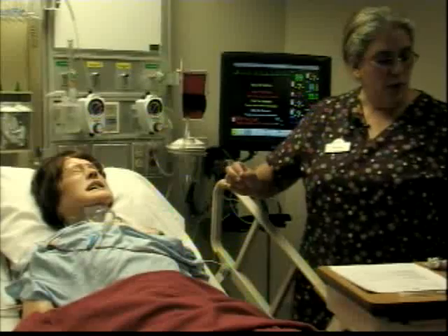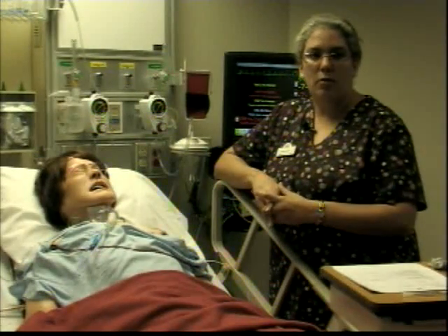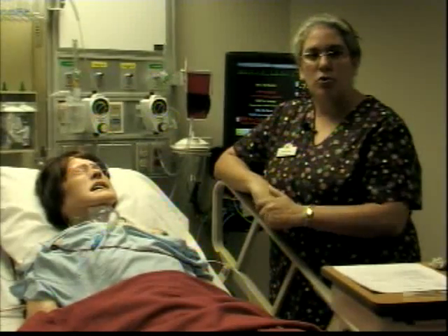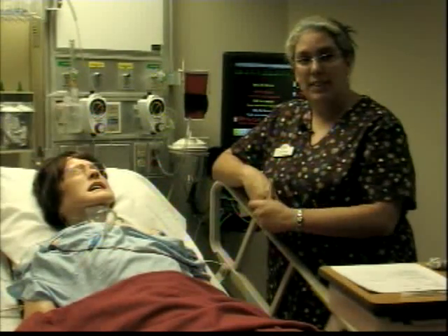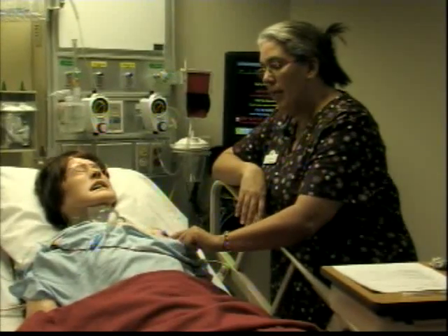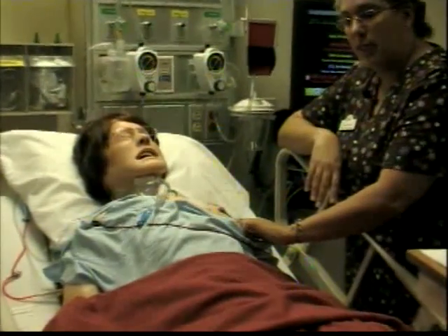So as we go into the patient's room, again, you already have gathered all that information from the patient's medical record, nurse's notes, etc. And you come into the room, you introduce yourself to your client, you verify their name, their armband, and do a general survey of the site. And that's when you're going to come in and take a look around the dressing. Are there any breaks in the skin from the dressing?